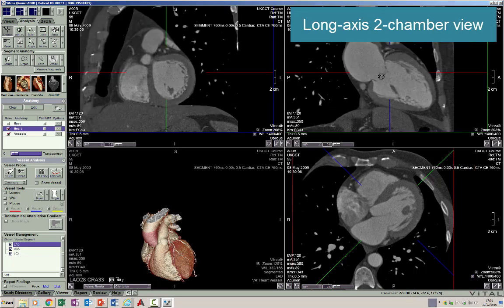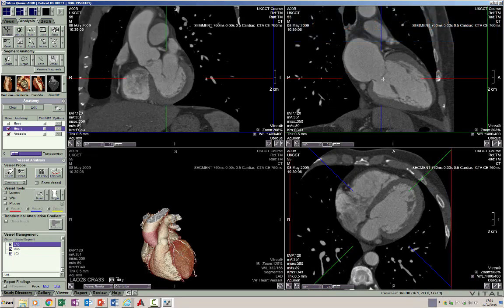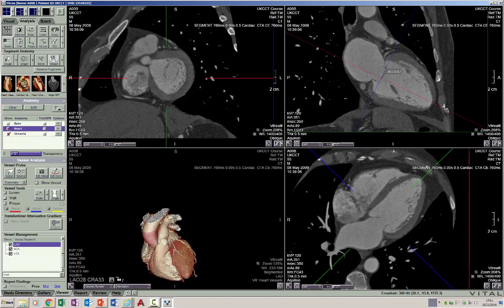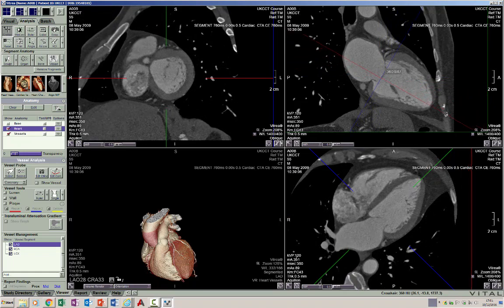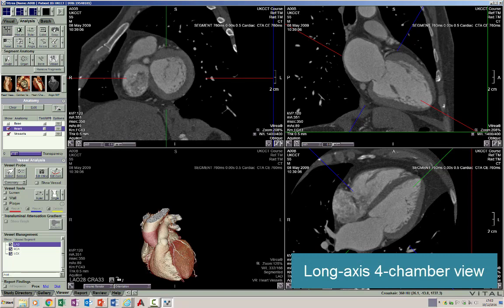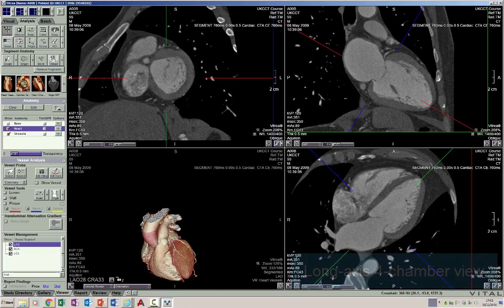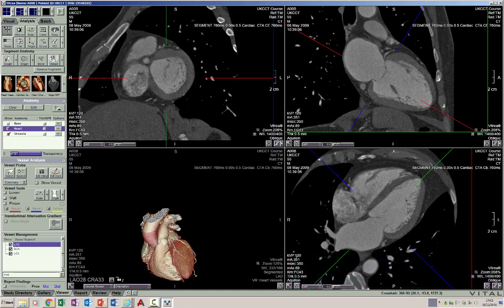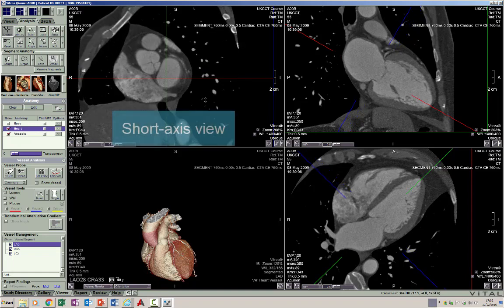If on this view I center my crosshair roughly in the center of the mitral valve and then rotate the crosshair to pass to the apex of the left ventricle, what I am doing on the bottom right panel is creating a long axis four-chamber view of the heart. These are the two most commonly used long axis views. The software has already created a view perpendicular to the long axis, and this view on the top left corner is the short axis view through the heart.